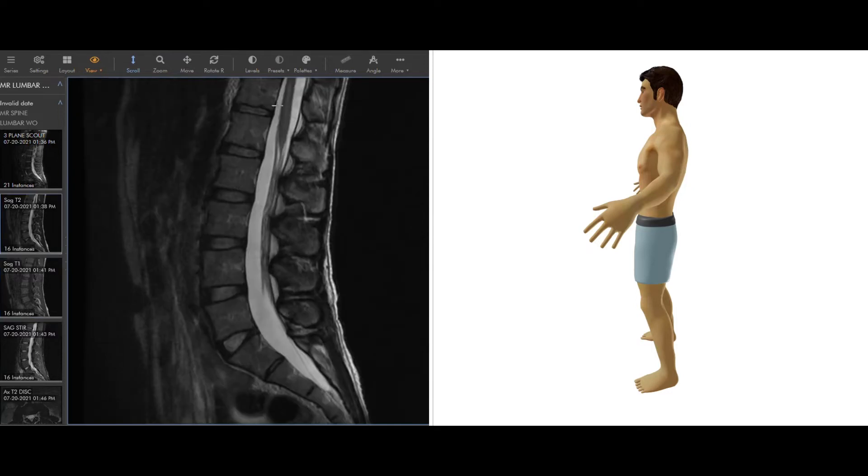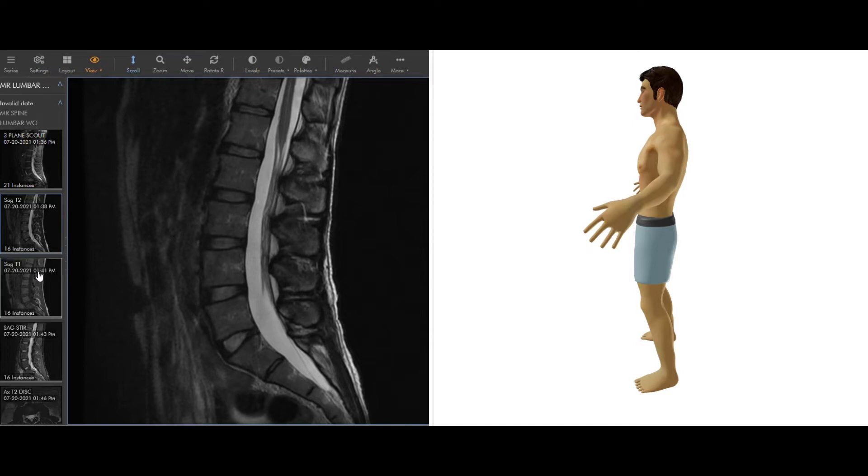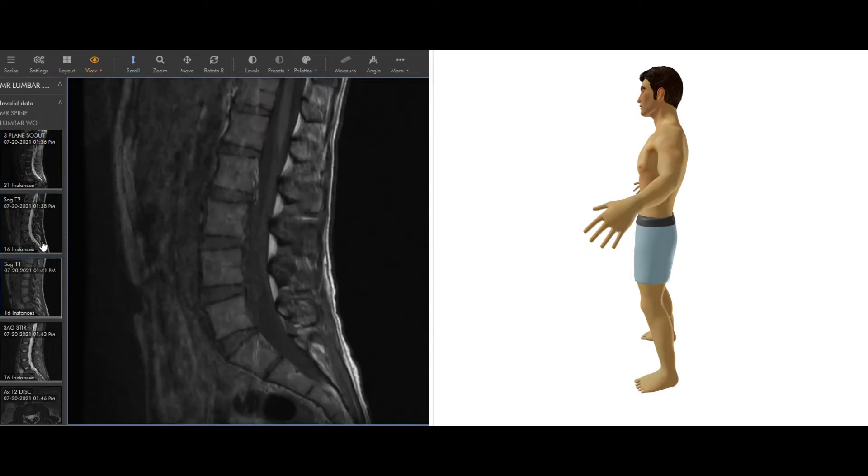On T2 here we can see the spinal cord is that gray color, but then the fluid is white. Intervertebral discs normally have some fluid in them, that's why they're brighter on this T2 as compared to this T1.